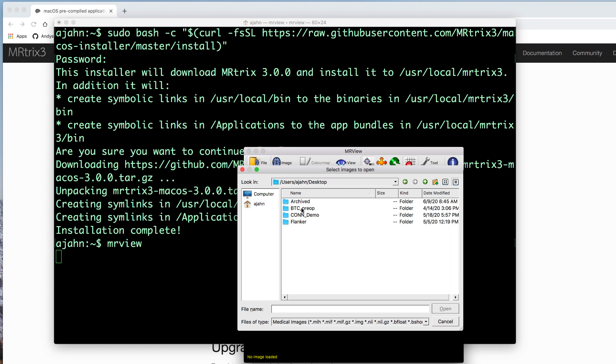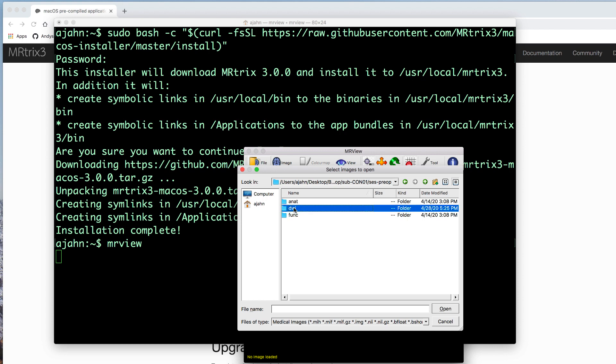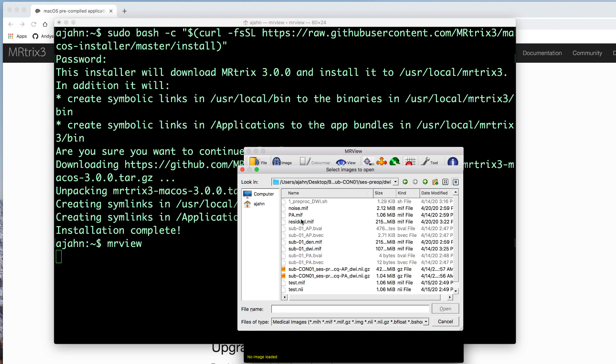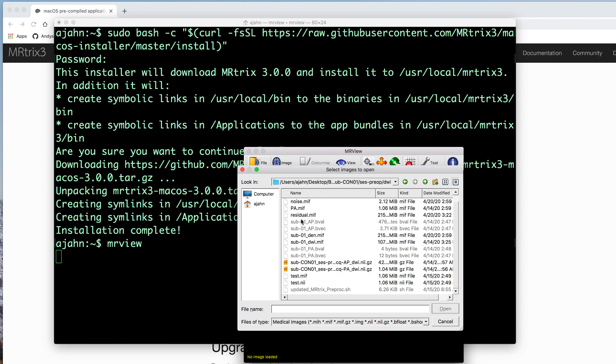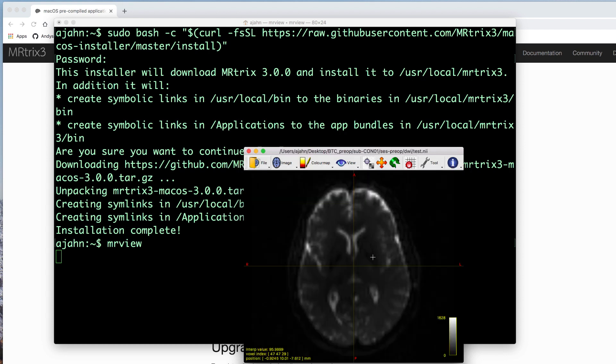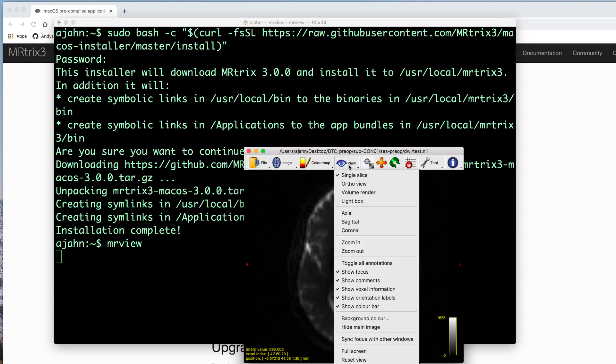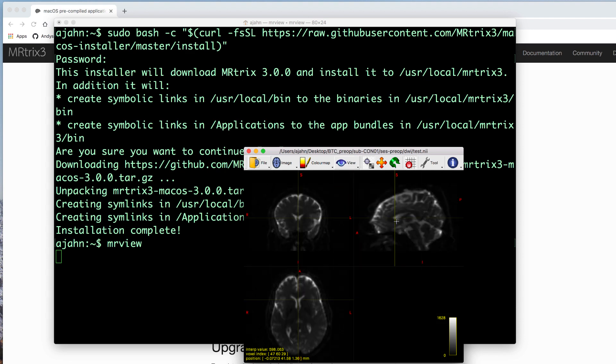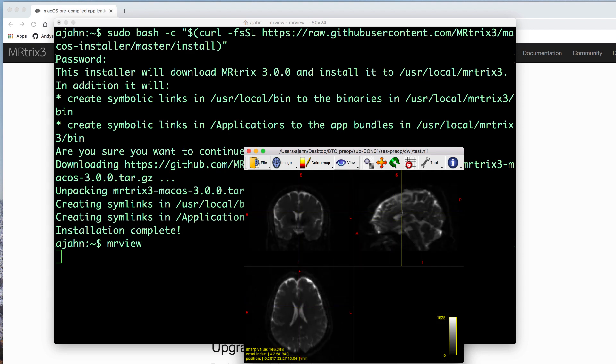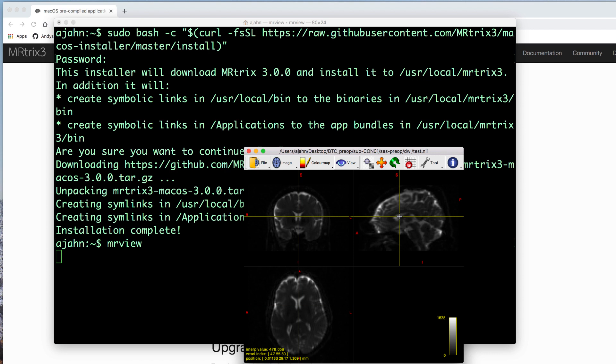In this case, I'm going to open a diffusion-weighted image that I've already pre-processed. We'll talk more about the MR-Viewer in a later chapter, but for right now, play around with it and see the similarities between other image viewers of other software packages you've used.